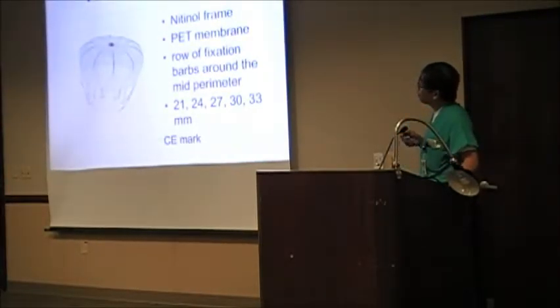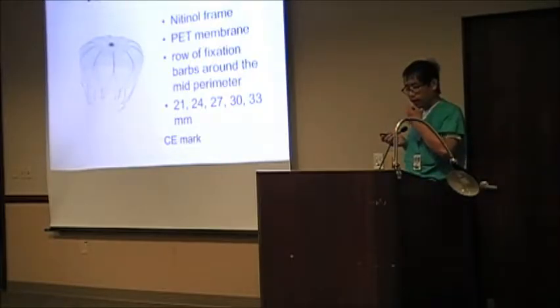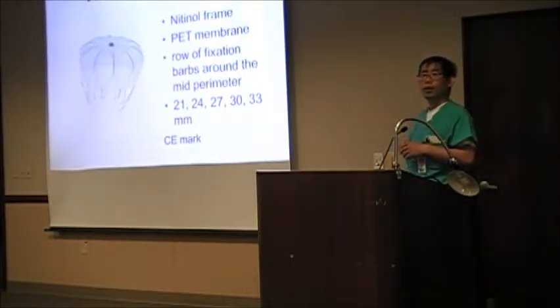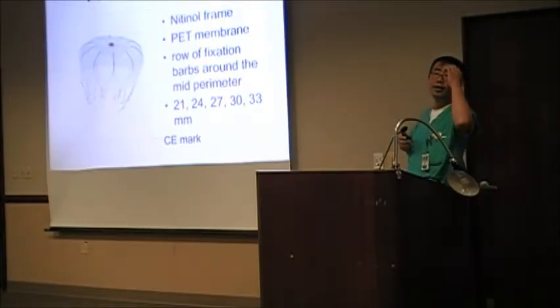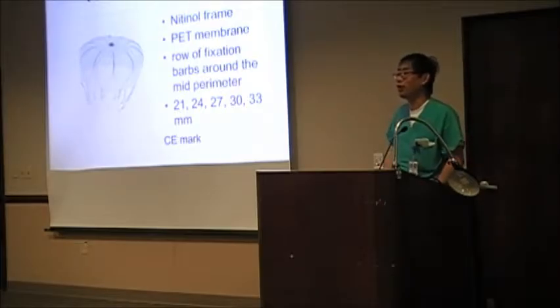So this is the Watchman device. I don't know what you would call the shape. Dr. McKinney, what do you call this kind of shape in English? Umbrella or fish? Okay. Jellyfish? What do you call that?